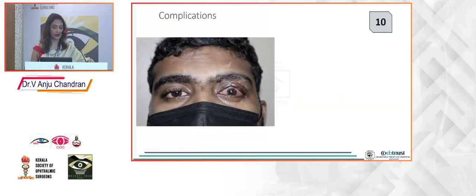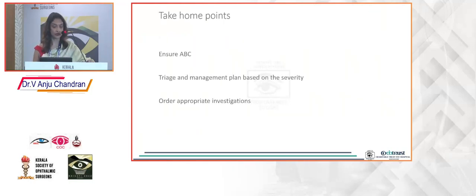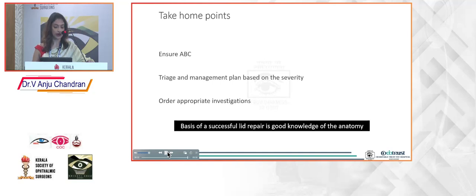If not sutured well, you can have complications such as this, where you have a bad lid contour, lagophthalmos, and you also have notching and a cicatricial component, which will require other scar management. So the take-home points are: ensure ABC, triage and manage plan based on the severity. Most importantly, have a good knowledge of the anatomy.